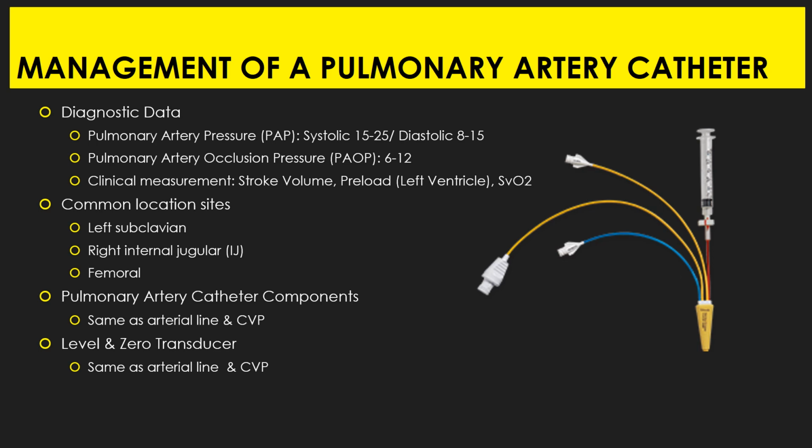We also know this as a Swan-Ganz or a SWAN. This device is invasive and it sits in the pulmonary artery. Swan-Ganz are not common, and so I'm not going to spend much time discussing them. In my own nursing career, I hadn't seen a Swan-Ganz until about 2 years ago, and I see a Swan-Ganz maybe once every few months. We typically only see them in cardiac patients with right ventricular failure.